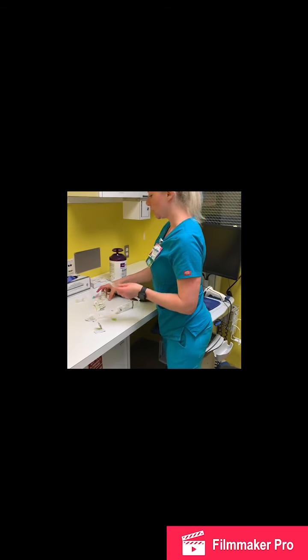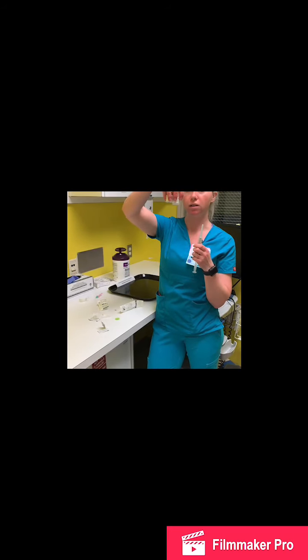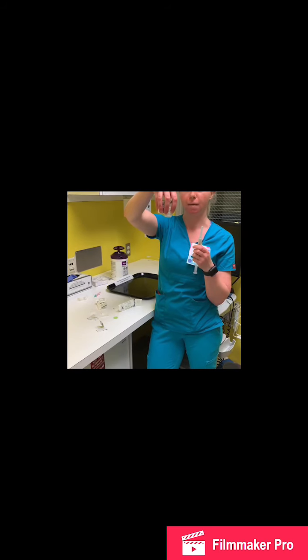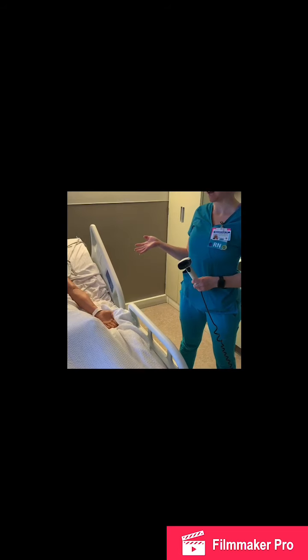I'm then ready to go into my patient's room. I'm going to take my medication and I'm going to take my 2 vials in there because I need to scan both of these vials into Epic prior to administering my medication. All right, so we're in our patient's room now.